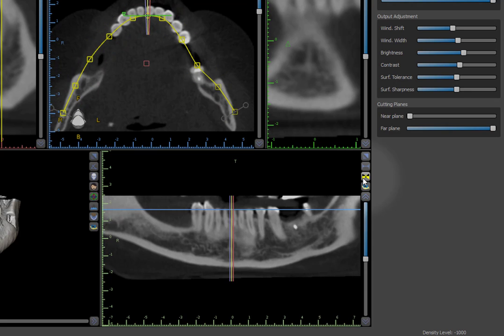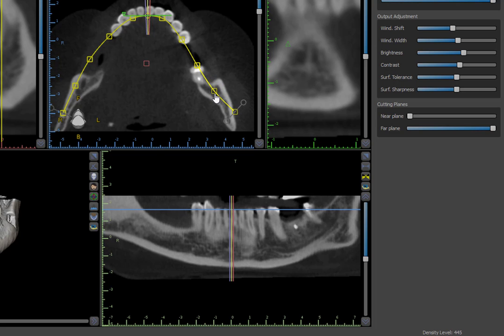The adjustable panoramic curve is found in the axial image contained in the top center view. When in single-slice view, adjust the curve by left-dragging on any of the yellow control squares on the curve. This may help present the pano view more clearly or to help focus on specific anatomy, such as when trying to identify the nerve canal.